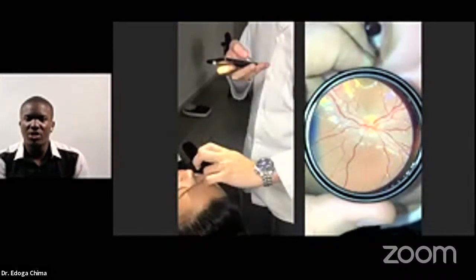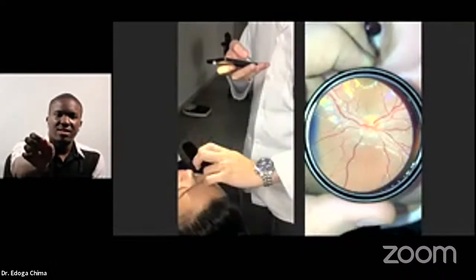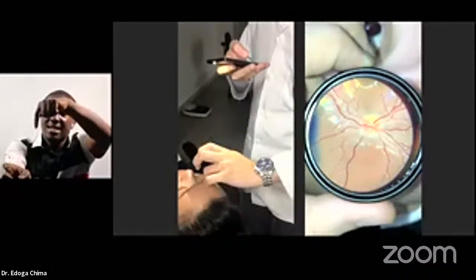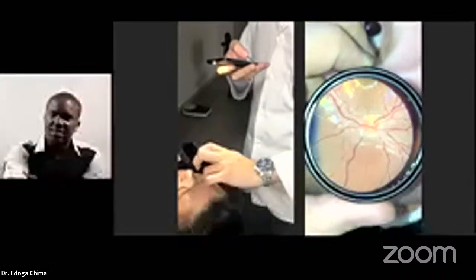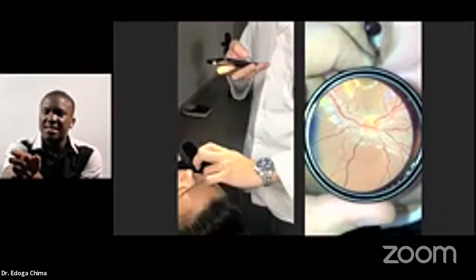So if you are holding your hand like this and you're examining the patient, gravity is acting on your hand like this. After a while, you want to lower your hand if you are examining this patient sitting up.